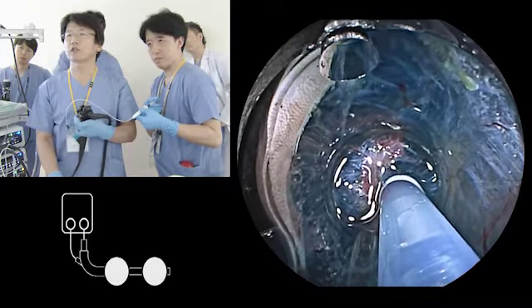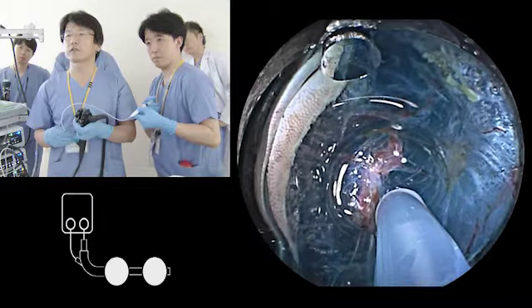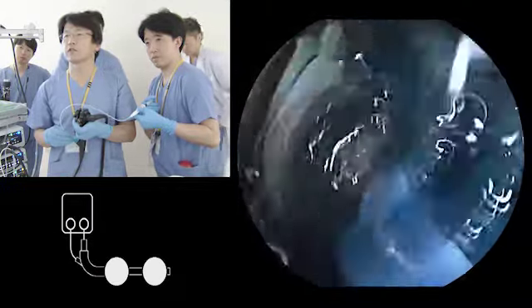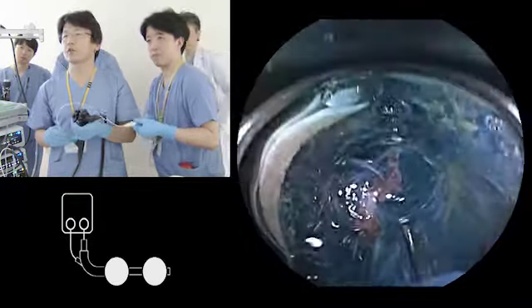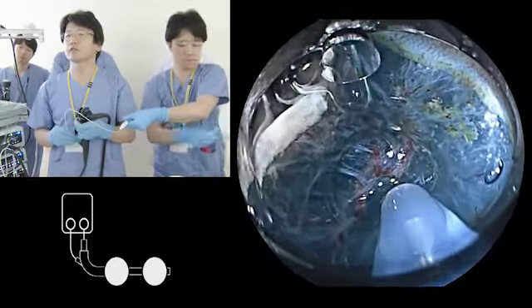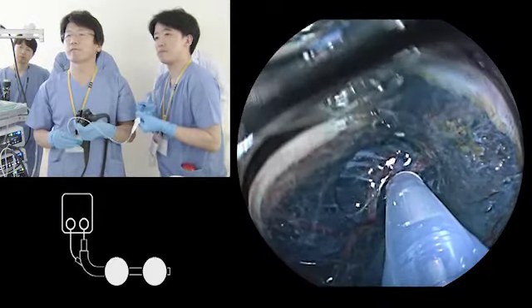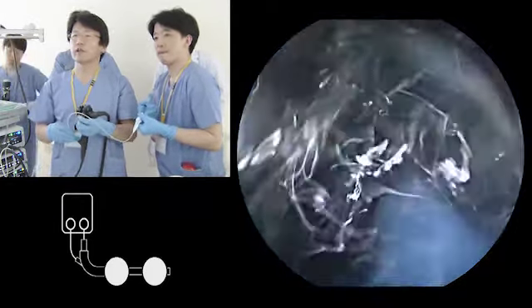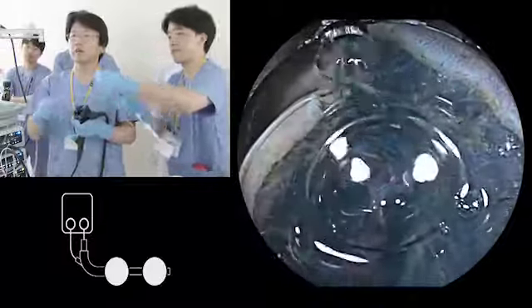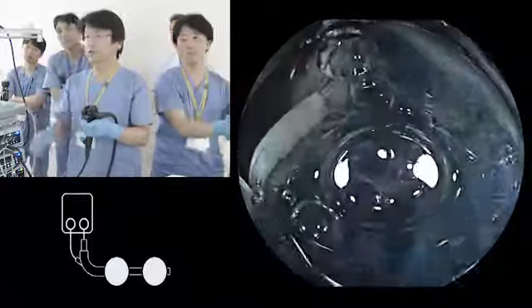The material is viscous, so I can selectively thicken the submucosal tissue, either the deep layer or a shallow layer. I don't want to touch the vessel, okay? Then, after I get a very stable condition, I can use the injection through the knife.